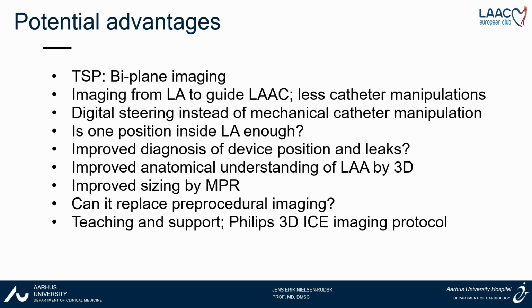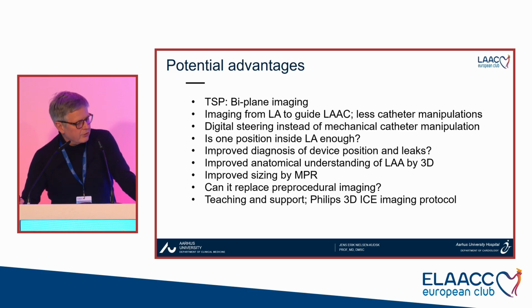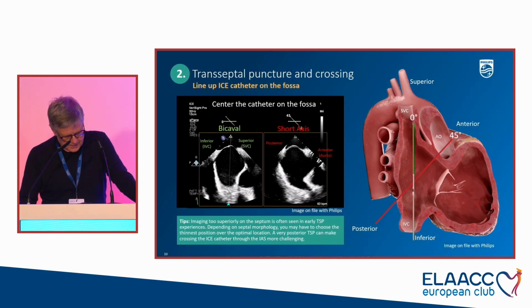I think along with intracardiac echo, it's extremely important that we make sure to get very good education and support. And I will say that this has been part of the Philips preparations for launching this catheter. They have a very, very nice imaging protocol and teaching materials. And I also know that they will really prioritize getting good support when we start to use this catheter.